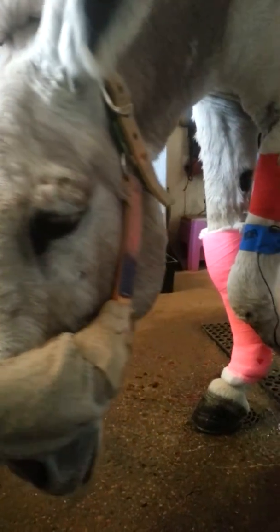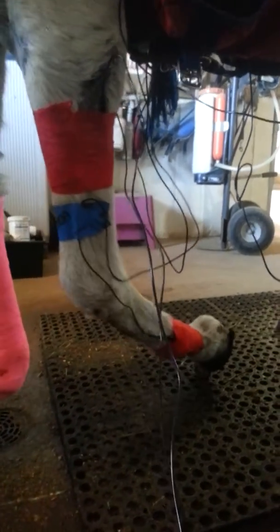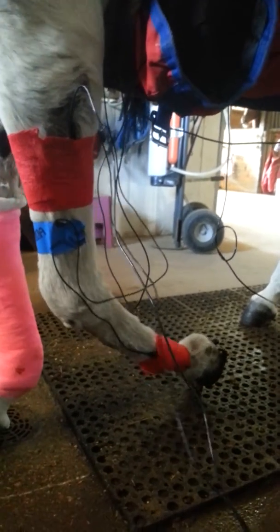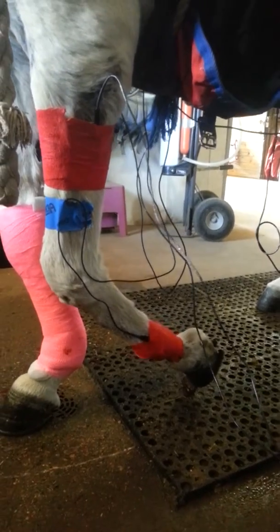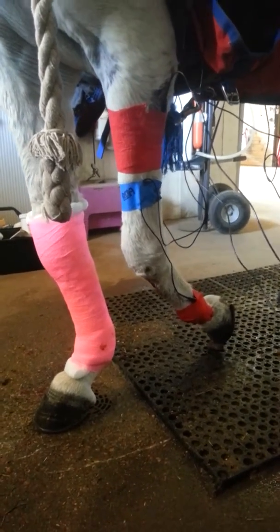This top one came out, but I'm not using that one anymore. One more at 30 seconds. All we're treating now is muscle, connective tissue, and everything to try and get rid of any of the scar tissue where we started off with the injury.